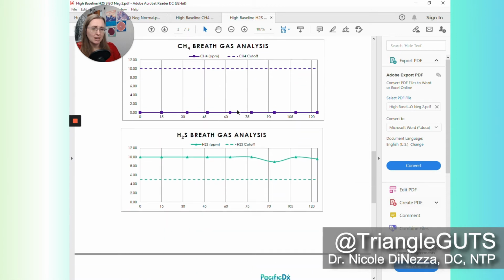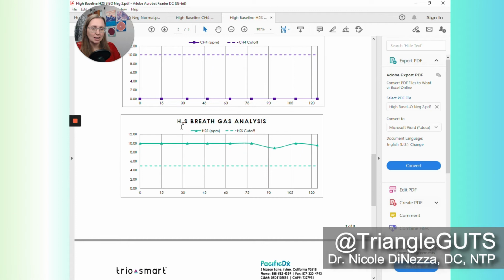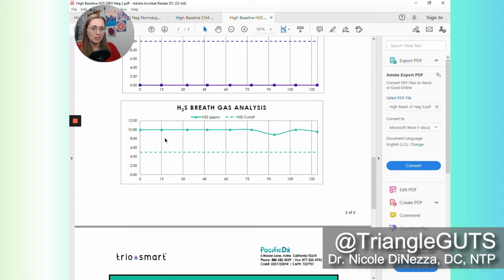Then you can see methane is nada mucho, so that's fine. And then we see another good example of an elevated hydrogen sulfide baseline, and it persists and is high throughout the whole test. It takes a little tiny dip at the 90-minute mark, and then it goes right back up. This is colonic hydrogen sulfide overgrowth, if I ever did see it. This is not going to be small intestinal bacterial overgrowth with hydrogen sulfide necessarily.